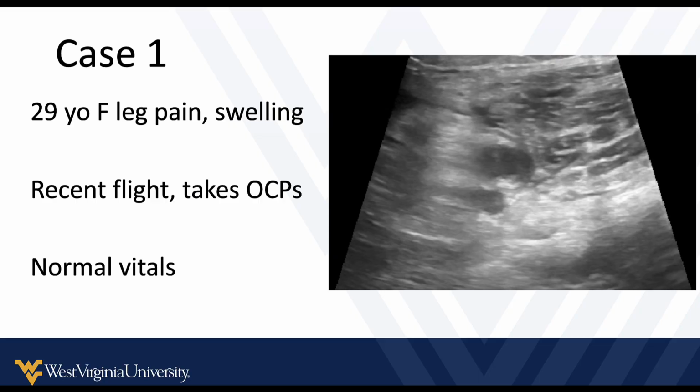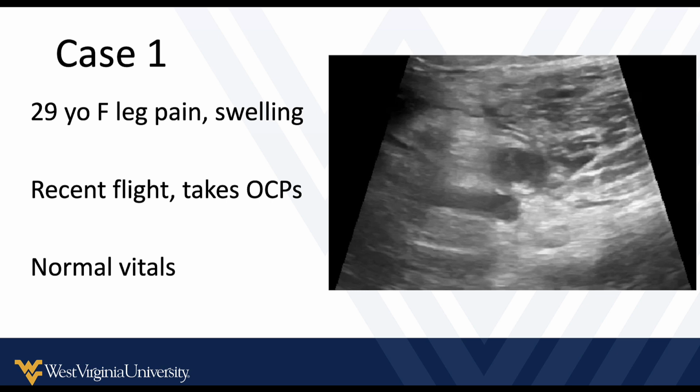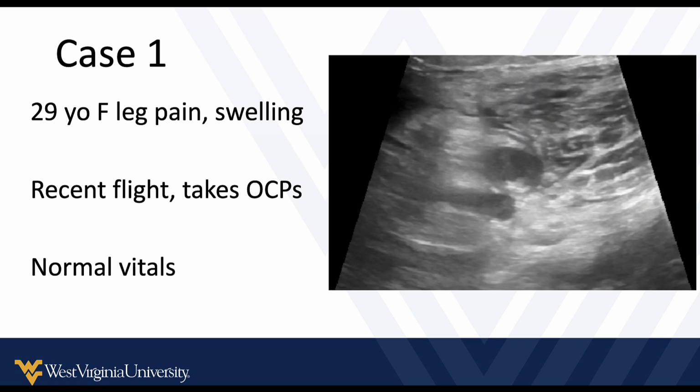We're going to start off with a couple of cases, and I will just mention that we'll not be covering detailed review of scanning technique and anatomy. To look for further information on that, please check out some of the other videos on my YouTube channel or on the Soul site. This first case involves a 29-year-old female. She has leg pain and swelling, had a recent transcontinental flight, and also takes estrogen-containing oral contraceptive pills. Patient otherwise has normal vital signs, and here's the image that we got for this case, and we will come back to this here very soon.